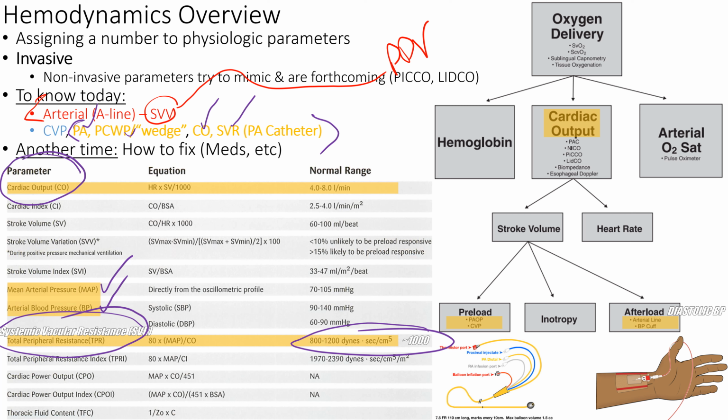They have to have 8 mLs per kilo. They can't have an open chest. But it is something that's useful. Right? And a lot of hemodynamics are invasive. There are newer devices that are non-invasive. An A-line is an invasive measurement, right? But that is not as bad as a PA catheter being right in smack in someone's heart. But we do have non-invasive devices.